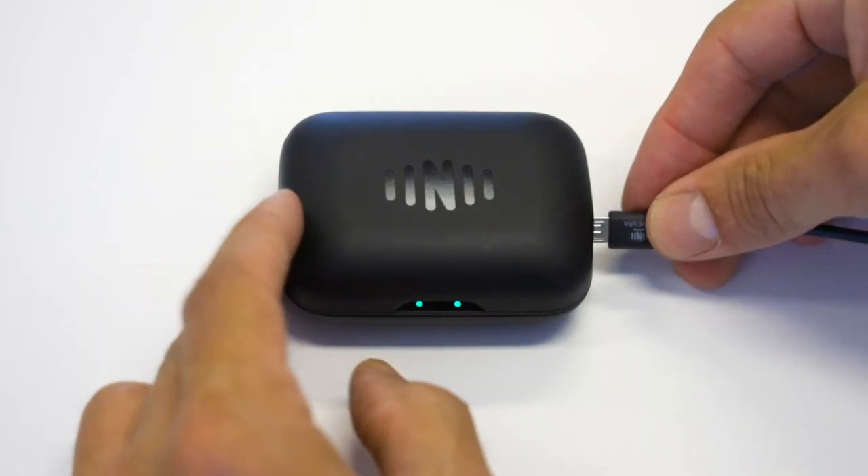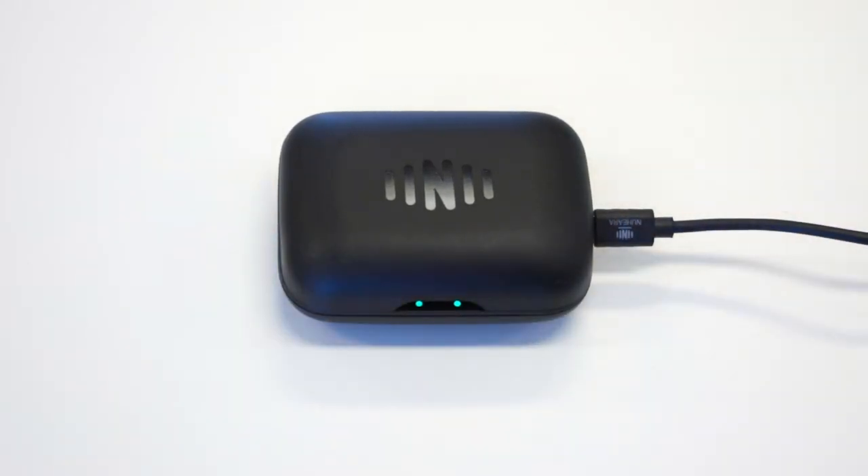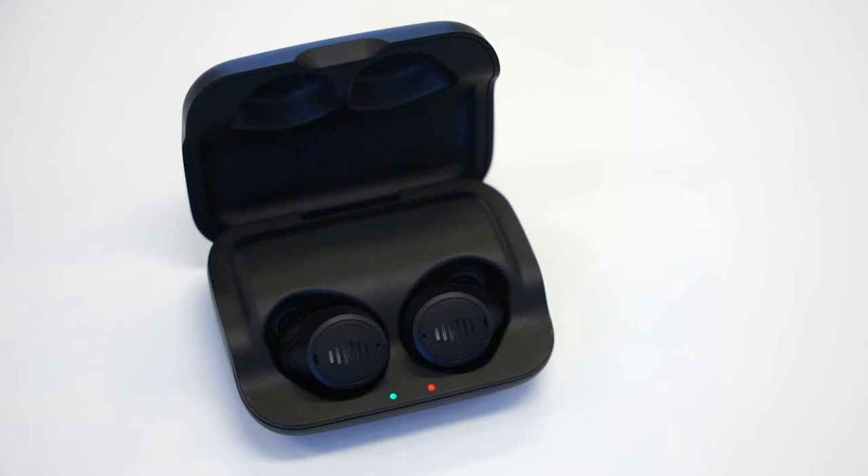Connect the USB cord provided in your box and then plug into a power source to charge both the case and the buds. The left and right lights on the front indicate the left and right bud respectively. A red light indicates that the buds are charging and a green light indicates that the buds are charged.